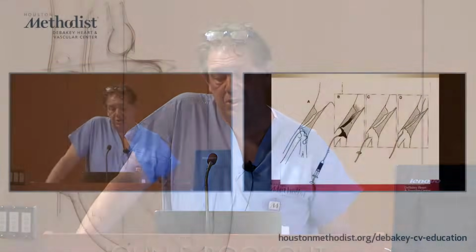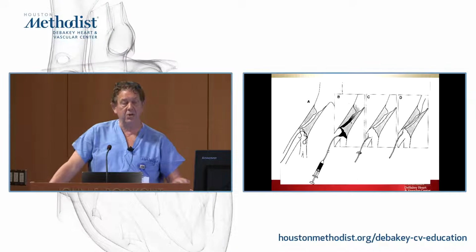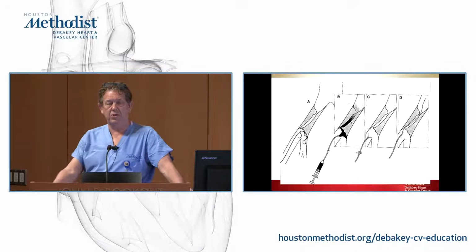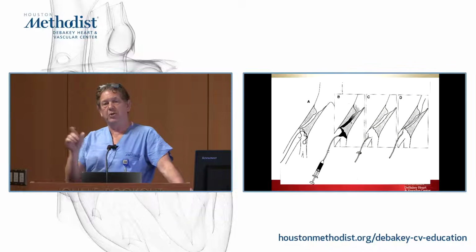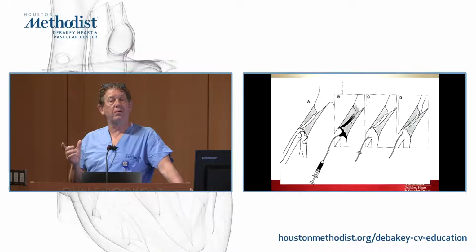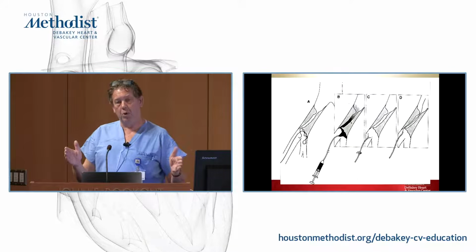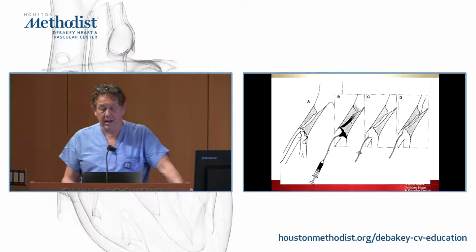And when you put a stent in something like this, we automatically are looking at this going, well, what are the challenges in stenting this? The challenge at the distal end is we don't want to jail the internal iliac artery, which means cover the internal iliac artery with a stent. This would be very difficult in this situation because the stenosis is right on top of the internal iliac. Generally speaking, you can measure this on these hybrid rooms, if the lesion is 3.5 centimeters long, then we're going to put in probably a 4 centimeter stent, maybe a little bit bigger than that sometimes. You need to overlap the proximal and distal end of the stenosis, and as you can see here, this thing runs right up to the origin of the internal iliac artery.